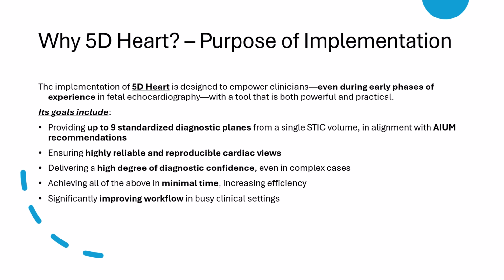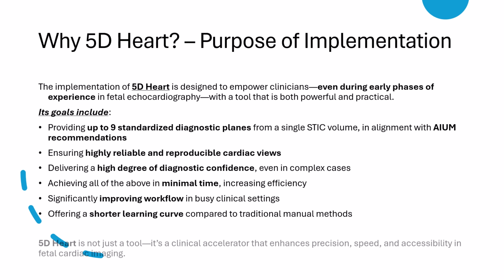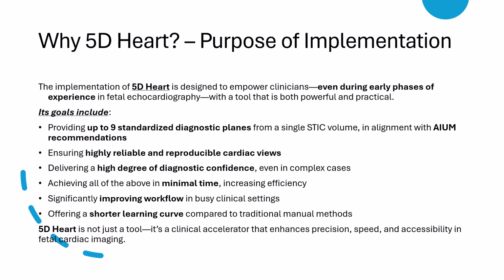Workflow optimization, which is invaluable in high volume clinics, of course. And crucially, the dramatically reduced learning curve, enabling clinicians to deliver expert level assessments much earlier in their training journey. In essence, 5D Heart is not just an imaging tool, it's a precision engine. It enables smarter scanning, faster reporting, and better outcomes without sacrificing the human skills behind the machine.